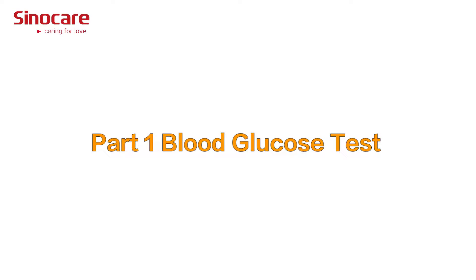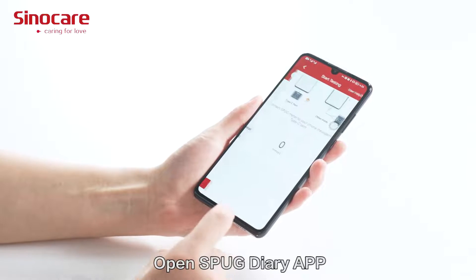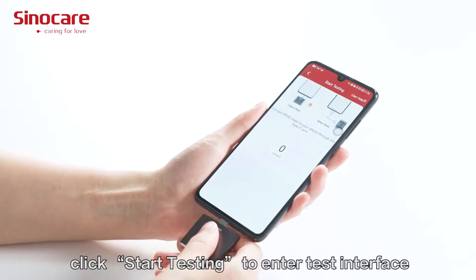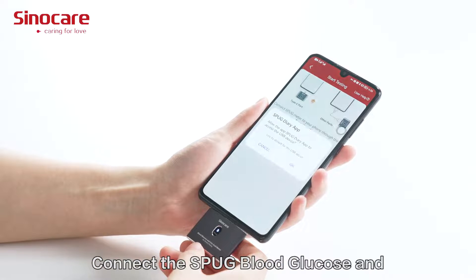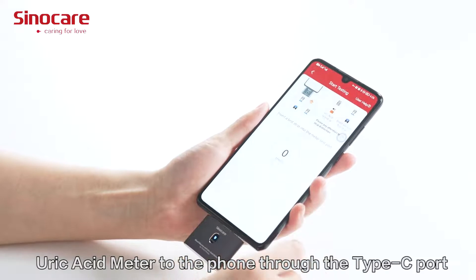Part 1: Blood Glucose Test. Open the SPUG Diary app and click 'Start Testing' to enter the test interface. Connect the SPUG Blood Glucose and Uric Acid Meter to the phone through the Type-C port.